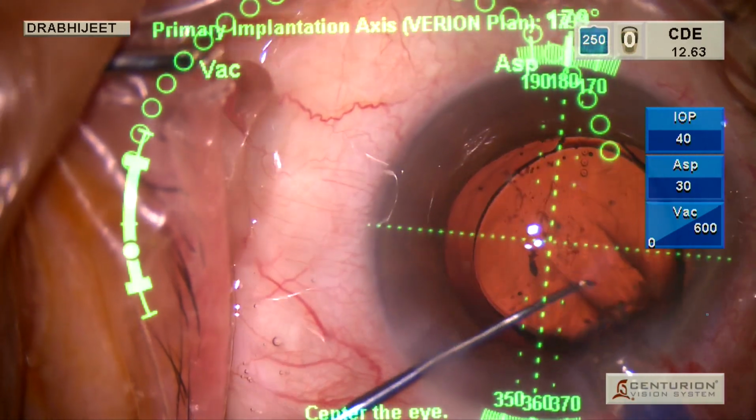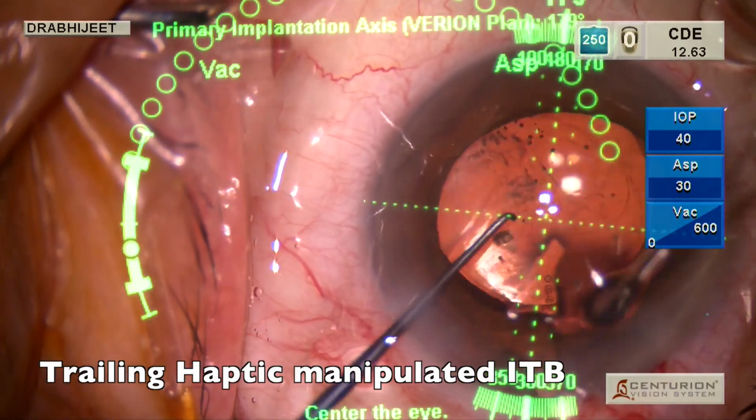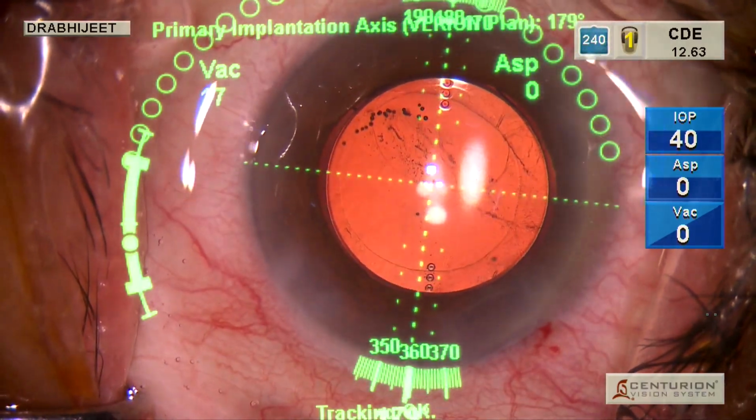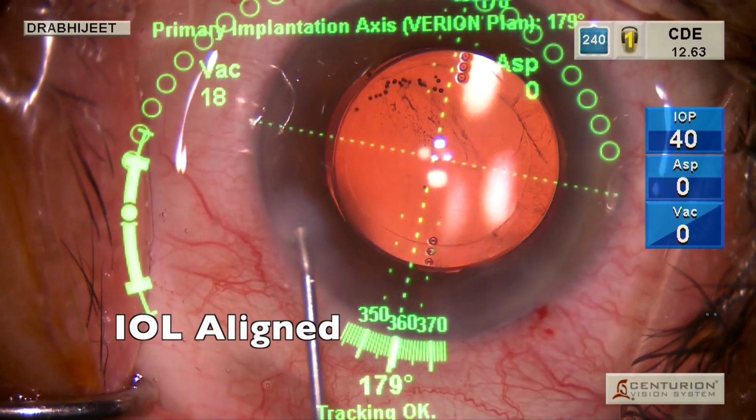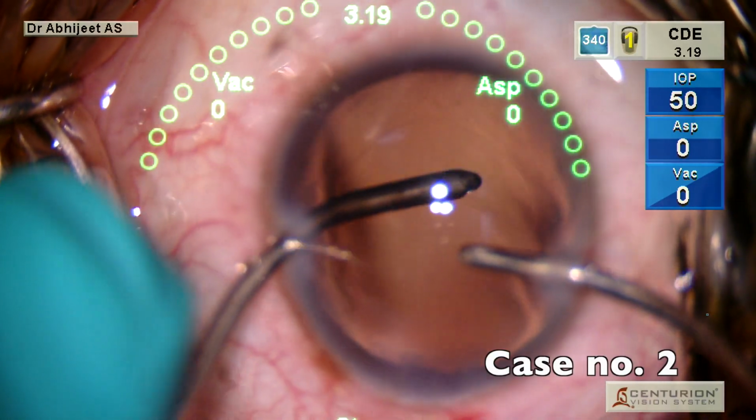Once we've done that, we put in an IOL carefully in the bag, and this is a Toric IOL which you can position as per your axis, which has to be aligned. And we go over for the next case now.